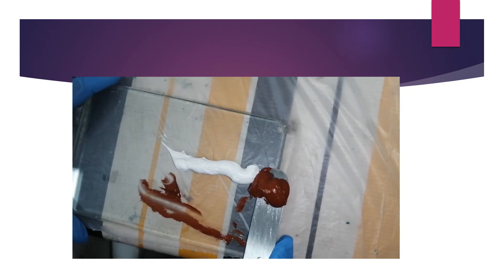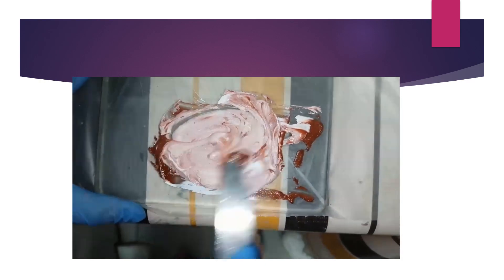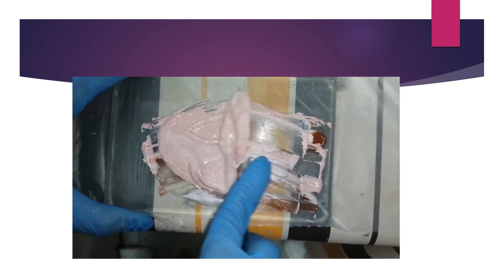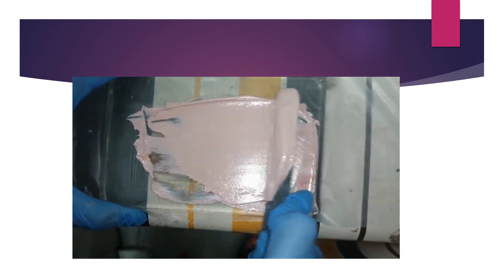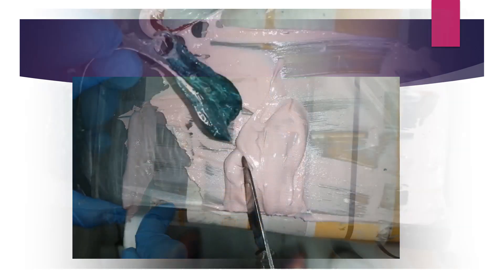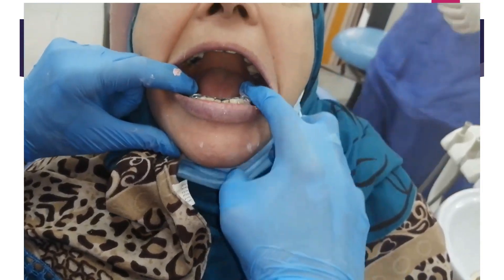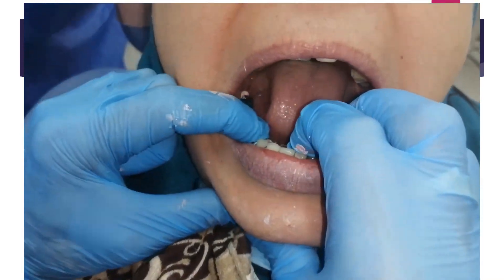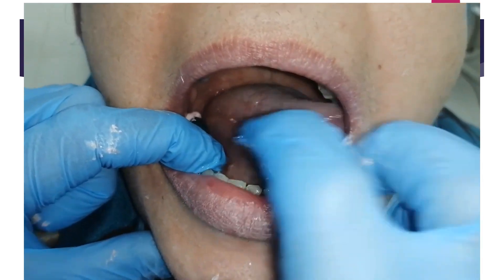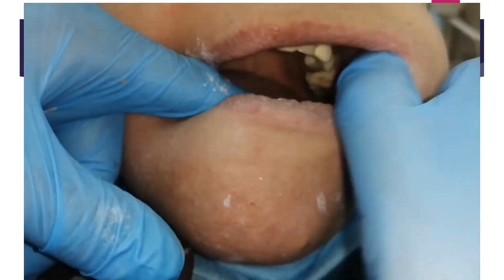Mix zinc oxide eugenol using equal parts of the two pastes, preferably on a glass slab using a zinc oxide spatula. Mix with a rotation movement until a homogenous color is achieved, then mix in one direction until all air bubbles disappear. Apply on the fitting surface, insert in the patient, and press firmly at the rests on both sides until all excess zinc oxide eugenol escapes. During trimming, do lingual border molding and trim the buccal borders.